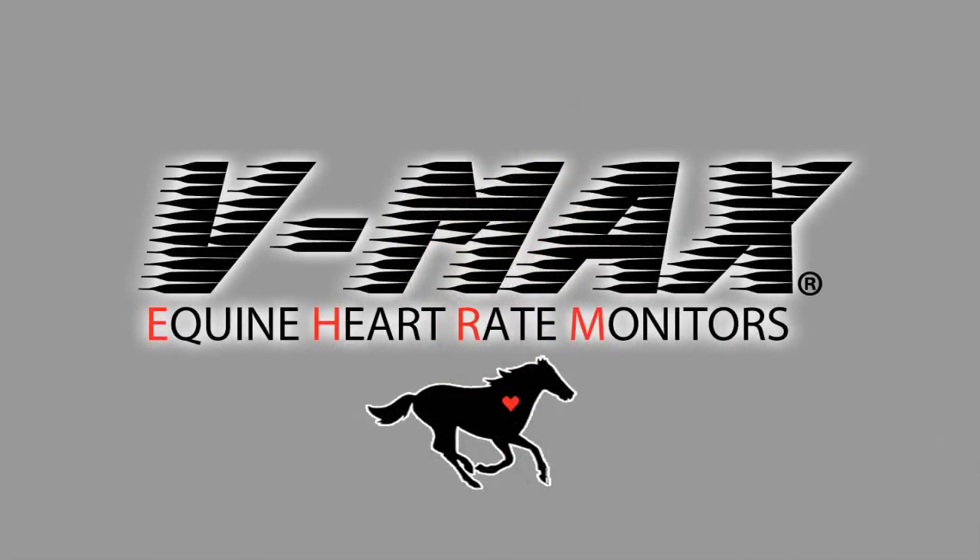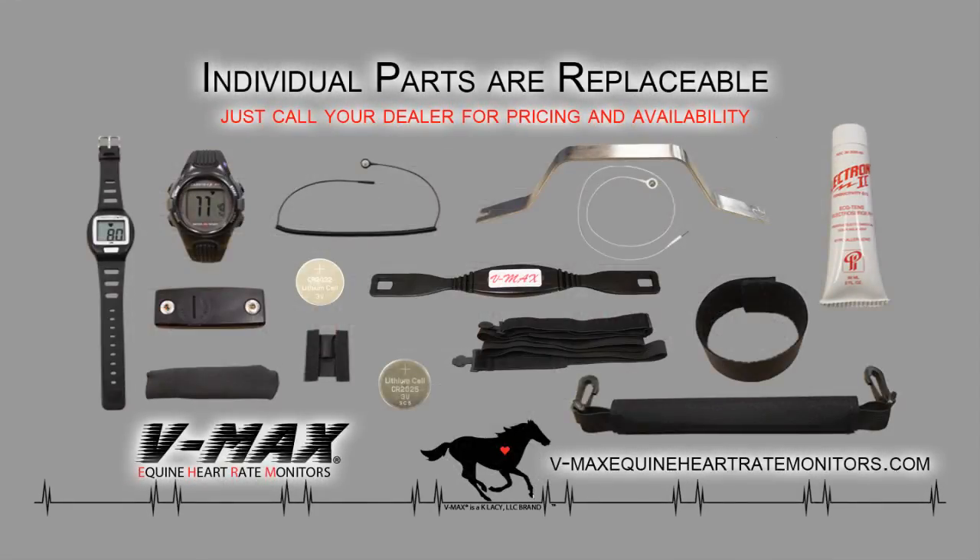Here is something unique to VMAX systems. Should anything happen to one of the pieces in your system, don't worry — that individual part is replaceable. Unlike other brands that force you to buy new systems, VMAX has available for purchase any part that you might need to replace.